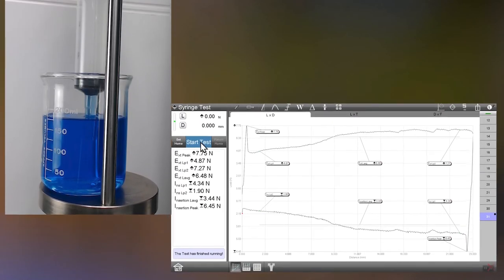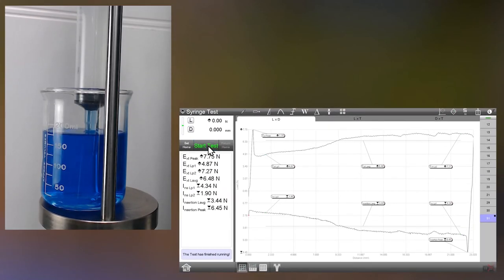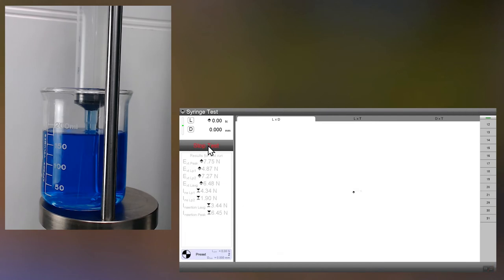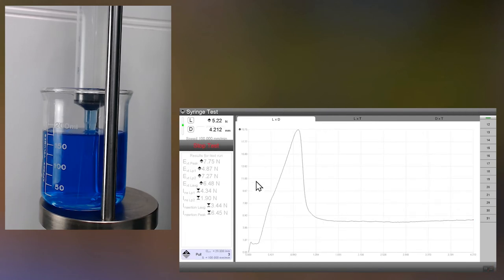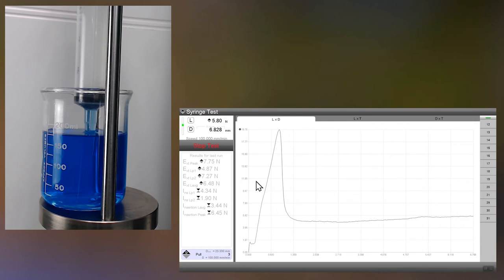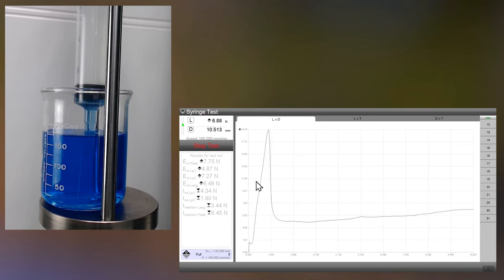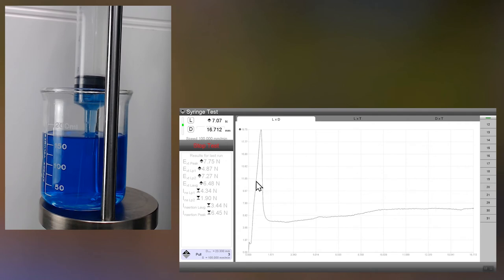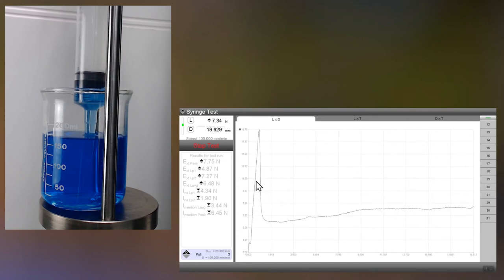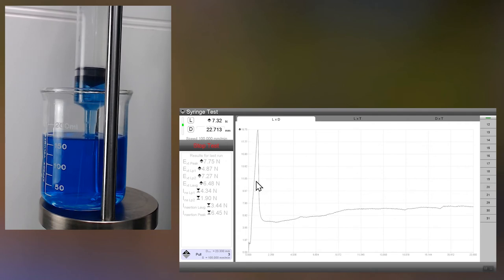So we're going to hit the start button here. You can see the system pulling. Now we're doing the extraction first like I mentioned earlier. So the first part of the data you're going to see is the extraction data up to the 23.33 millimeters. So there we go.